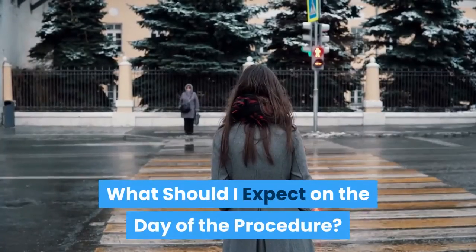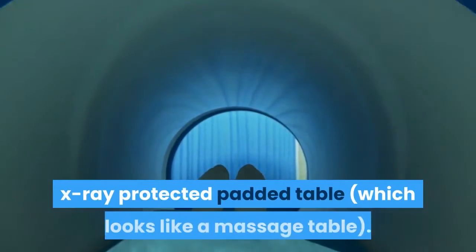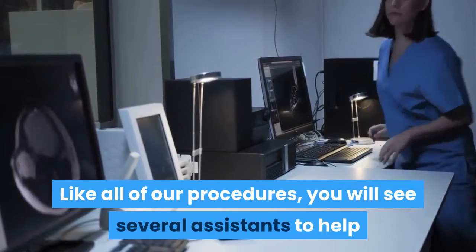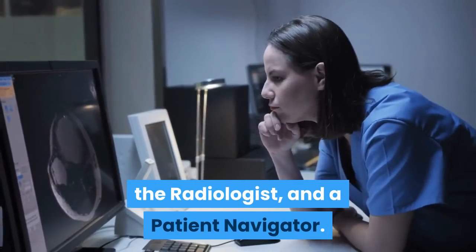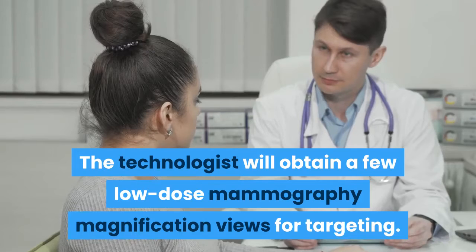What should I expect on the day of the procedure? On the day of the procedure, you will lie on your abdomen on a special X-ray protected padded table, which looks like a massage table. Like all of our procedures, you will see several assistants to help with the procedure: the technologist, the radiologist, and a patient navigator. The technologist will obtain a few low-dose mammography magnification views for targeting.